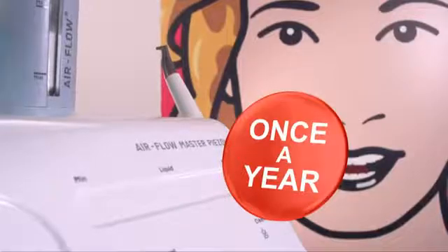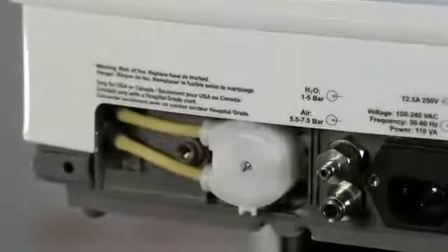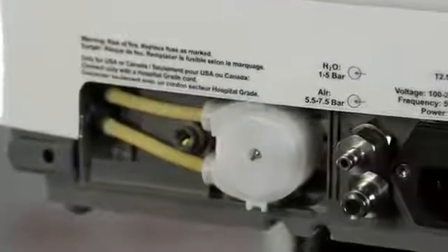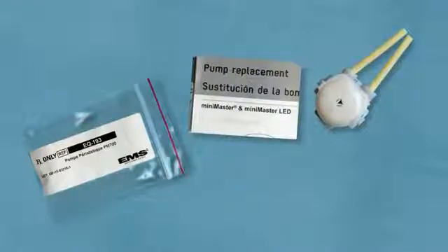To alleviate the effects of normal wear, we recommend that you replace your pump at least once a year, or more frequently if the flow decreases or becomes irregular. Install a new pump using the replacement kit. A detailed instruction manual is included with the kit.